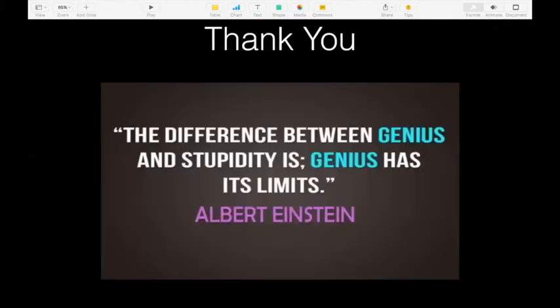And the thing which I would like to raise is a famous saying from Albert Einstein, that the difference between genius and stupidity is that genius has its limits and knows its limits. So you should know your limits. If you know that everything is available and ready in your center, then I think you should attempt ERCPs in such patients. But if you don't have a backup, or your surgeon is not very keen, or you don't have a surgical backup who can help you if the patient develops a complication after attempting such ERCP, it's better to wait for some time, gain some experience, and then attempt.